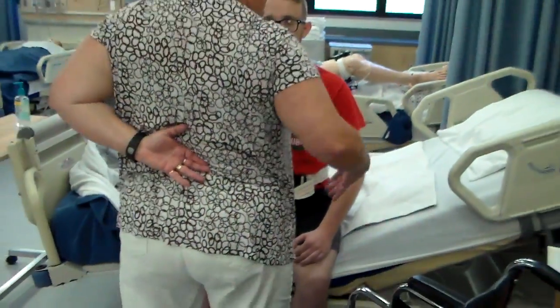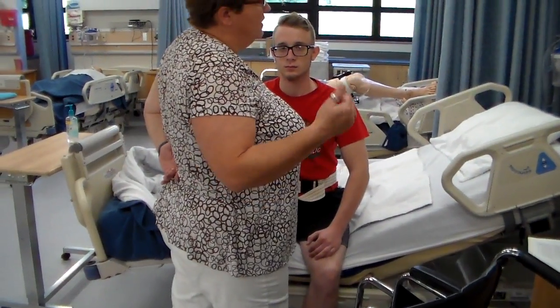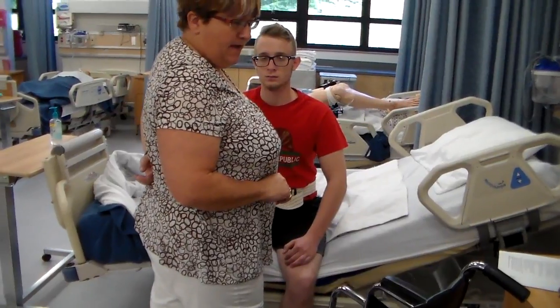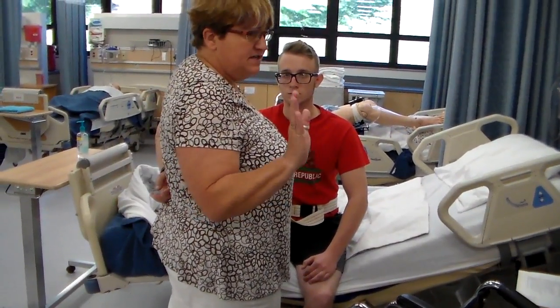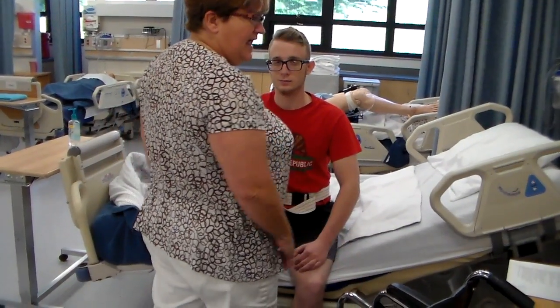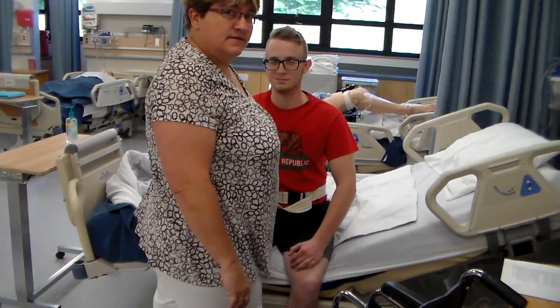So I'm not going to be doing this to lift him, right? Because where's all that going? All that pressure is right here in my back. You do that 1 or 2 times and you've now had a hurt back, okay? You're too young for that. Don't deal with that. You want to lift with the legs, especially you ladies, right?